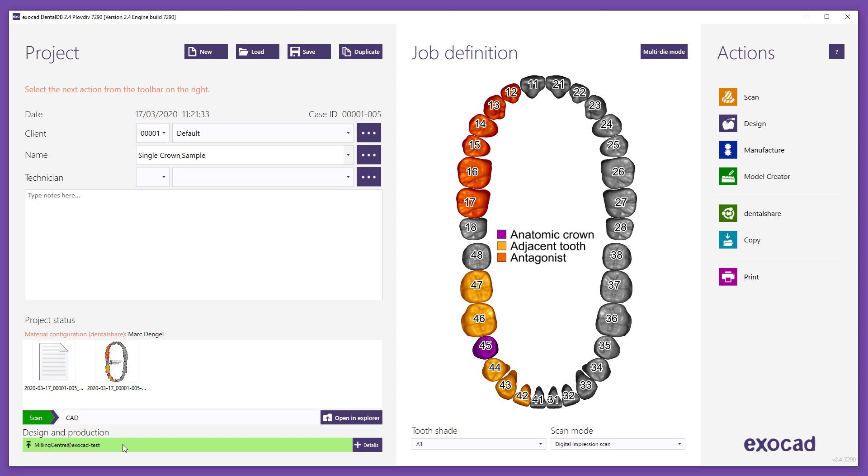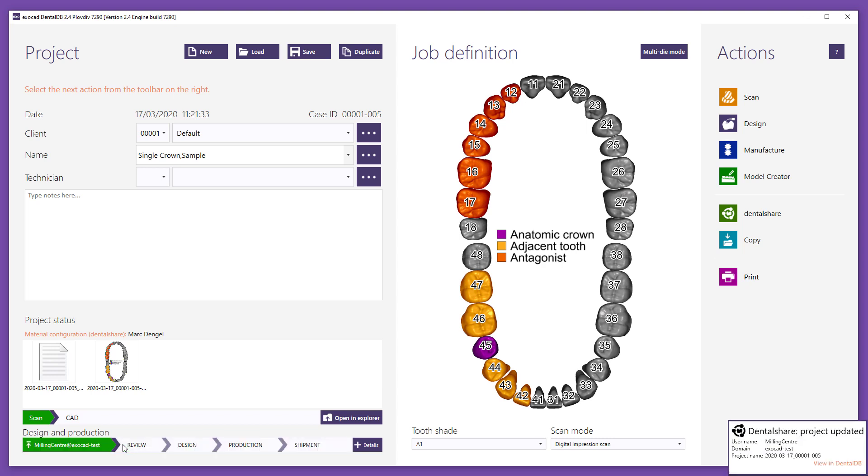Depending on the service you have selected, different workflows are performed and different steps appear. Orange means upload is in progress, and light green shows the upload is completed. On the status bar, the transfer direction icons show the direction of the data transfer and the recipient or sender ID. A multi-step bar indicates that the recipient has received the case in his DentalDB.